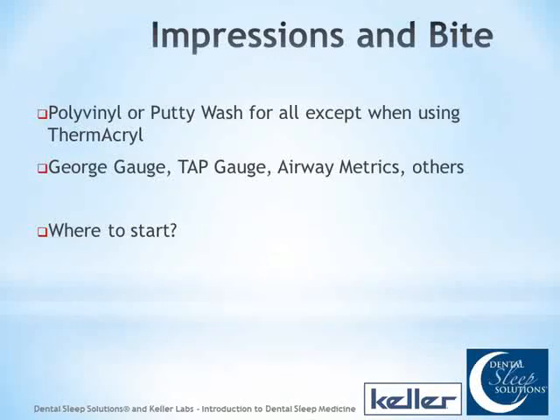You want to add anything to that? No, I tend to agree. It usually equates to between 40 and 60% of their maximum range of motion. And again, I like your idea of putting it in place, make sure it's comfortable. Also, depending on which one you're doing, make sure that you look and make sure that the bite's straight. They didn't bite to the left or right with the bite. That's another opportunity when you try it back in to make sure of that as well.